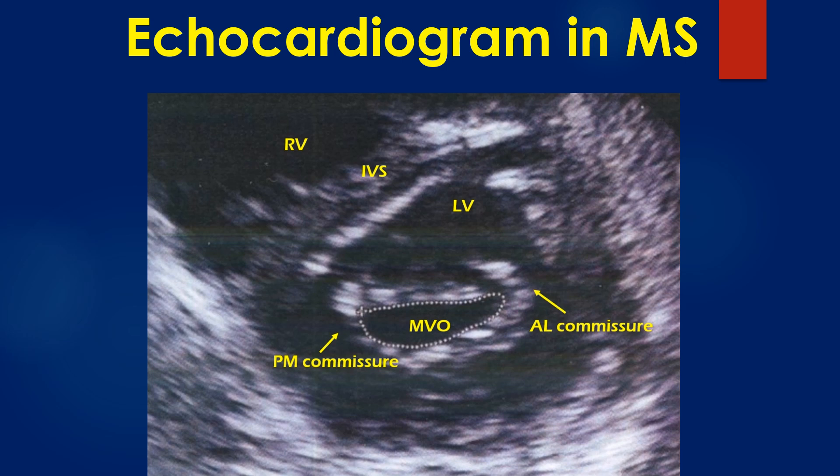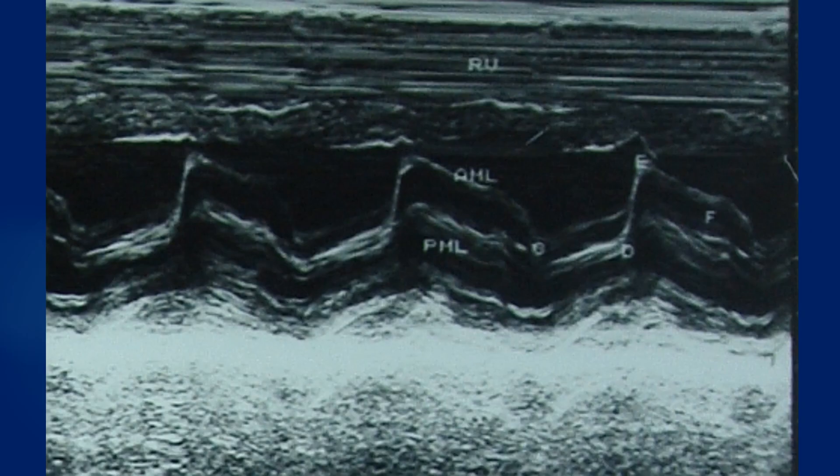Ideally, the smallest full circle should be taken to planimeter the valve area. If it is not a full circle, the subvalvar pathology may be measured as the valve orifice. If the smallest full circle is not taken, it will be the valve proximal to the severest stenosis, i.e., the valve belly. The M-mode echocardiogram shows the paradoxical anterior motion of the posterior mitral leaflet in diastole with reduced separation of the leaflets.